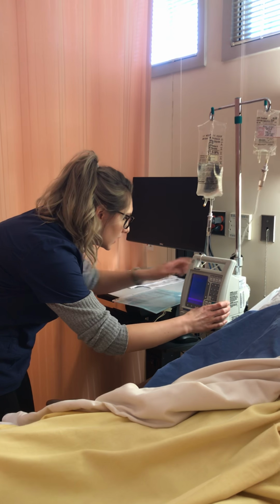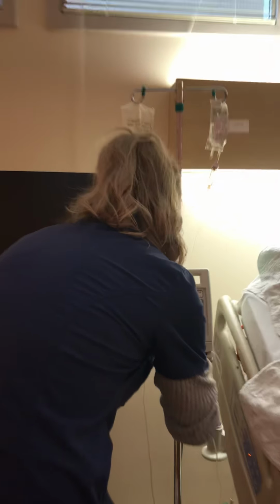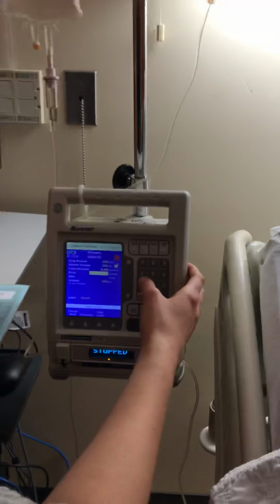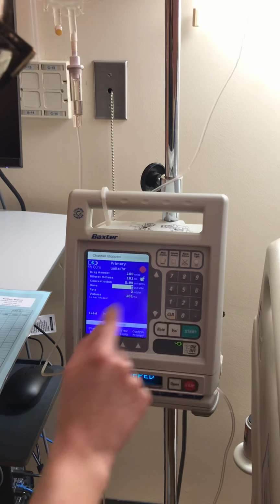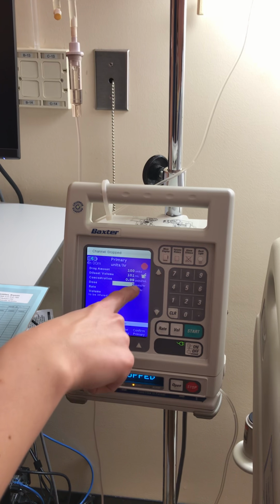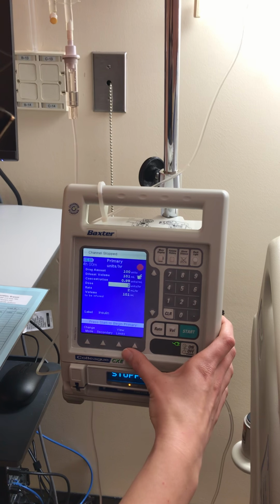Okay, so select. Okay, so it's already set up the drug amount, the diluent volume, as well as the concentration. So the dose that I'm giving is, as per ordered, 2 units per hour, and it gives me the rate that I already checked with the 2 milliliters per hour. I'm just going to confirm the primary.